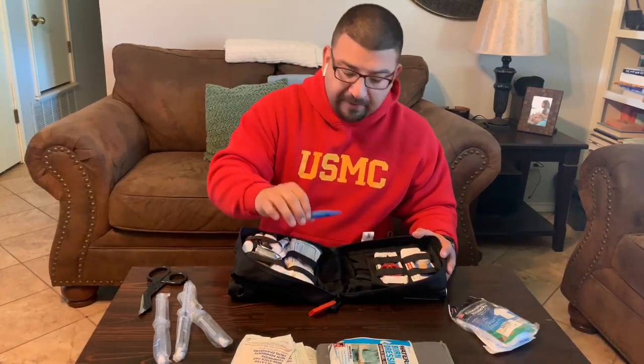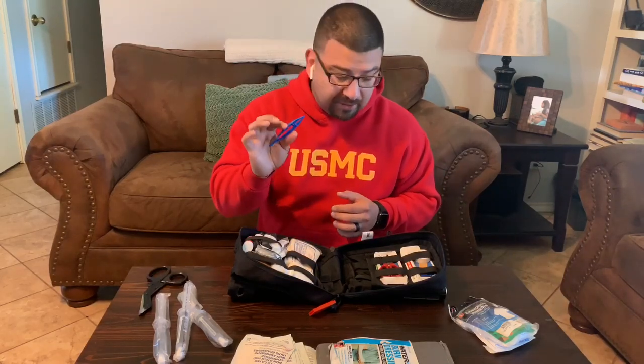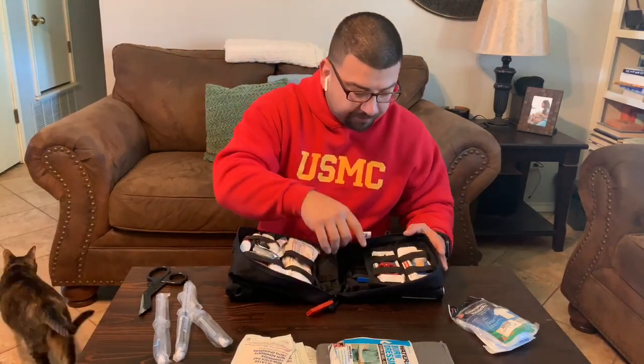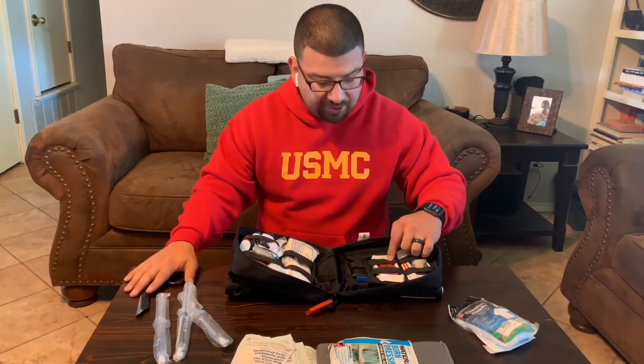The next thing I have is just little tweezers. This is just for very basic, if I need to pull something out, a splinter, something like that. I've not had to use these either, but it just came with one of my med kits, so I threw that in there. I have smaller scissors in here if I don't want to pull out the entire shears to cut little pieces of tape, stuff like that.